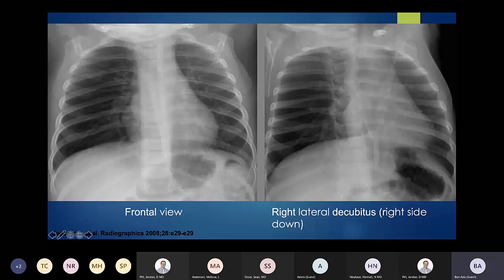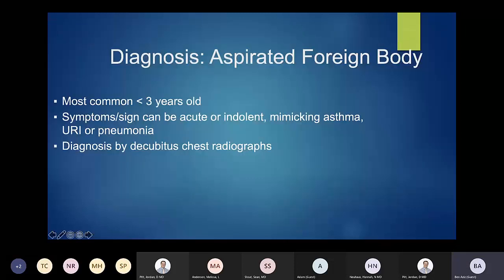The decubitus position can be helpful in detecting air trapping from aspirated foreign bodies. Aspirated foreign bodies can be acute or indolent — usually acute — and can mimic asthma with wheezing. If it's more of an acute picture, you're thinking more worrisome causes, and foreign body would be one of them.